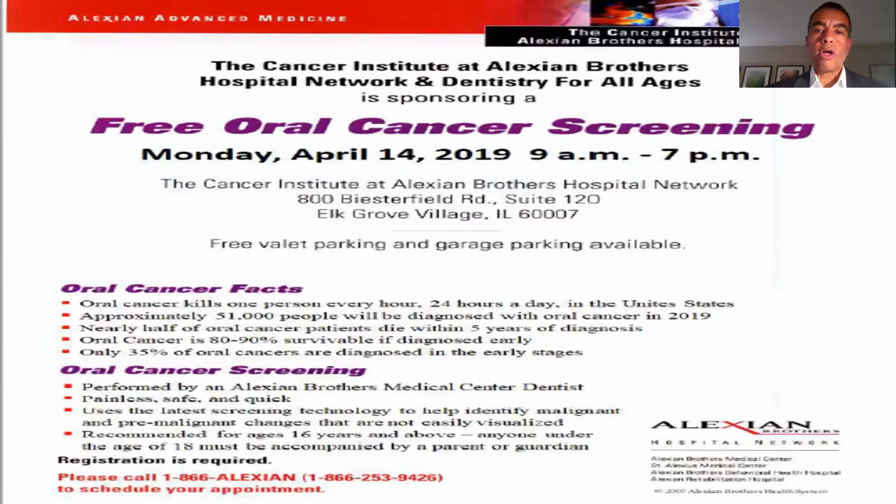Here's another example. Sorry for the blurriness of it, but this is an example of a doctor-coordinated screening event at a local hospital where they ended up screening over 150 patients and generated new patients because of that, but more importantly, they actually educated the medical staff at this facility, which led them to end up referring more patients to the dentist that coordinated.